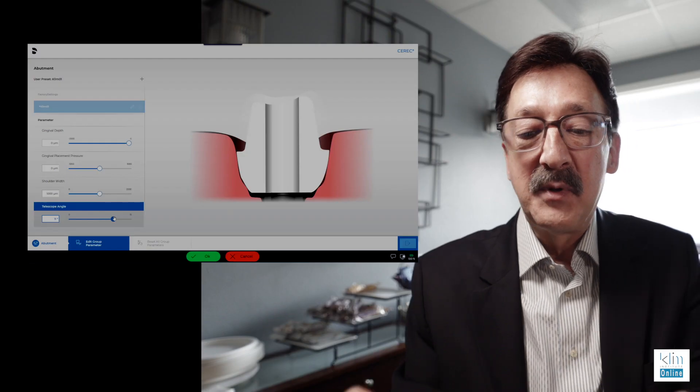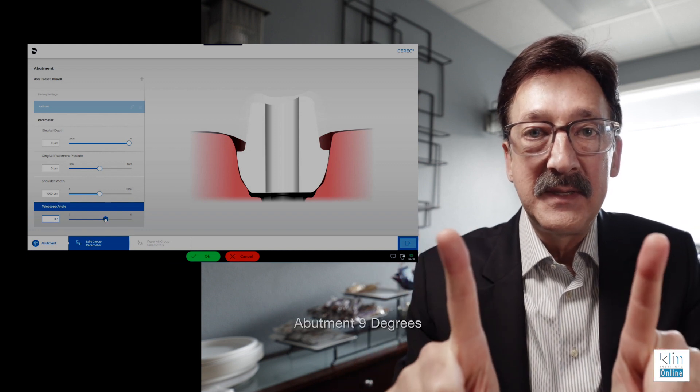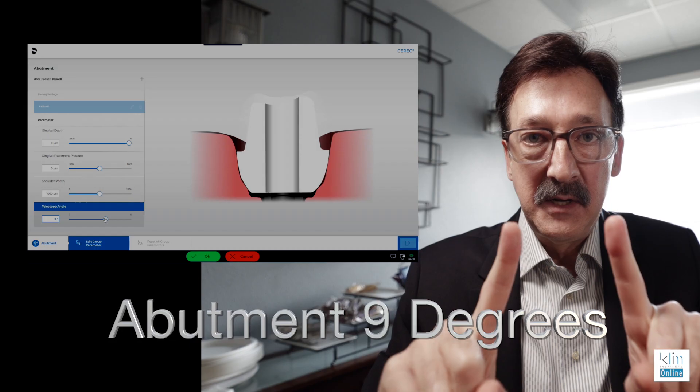The other thing I'm looking at is the draw on the prep. In your parameters, rather than six or seven degrees, I'm going to draw it at nine degrees.